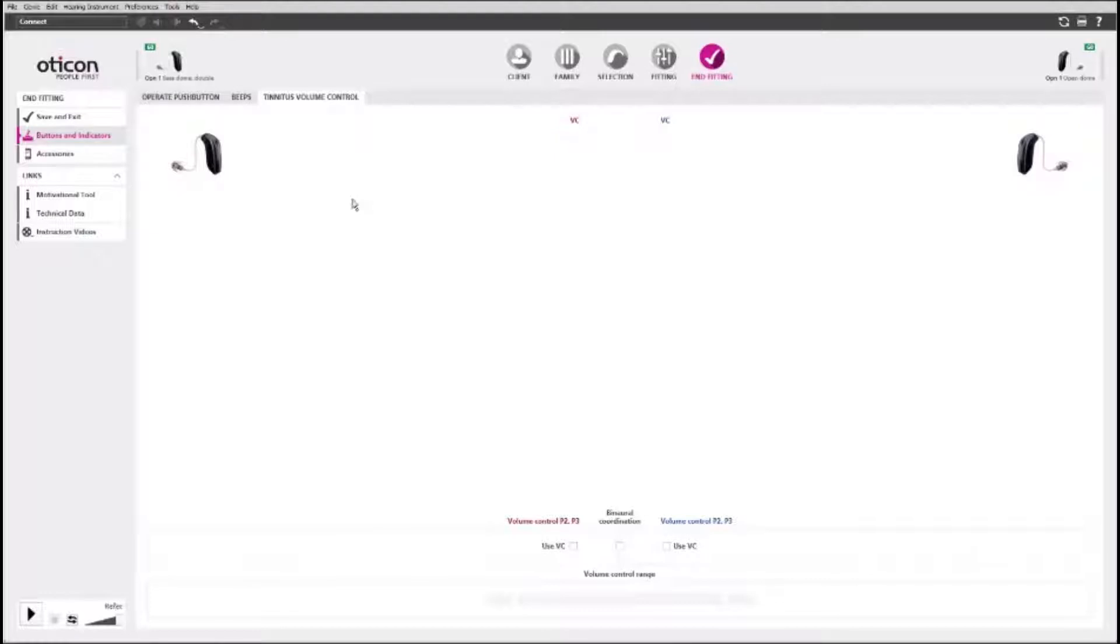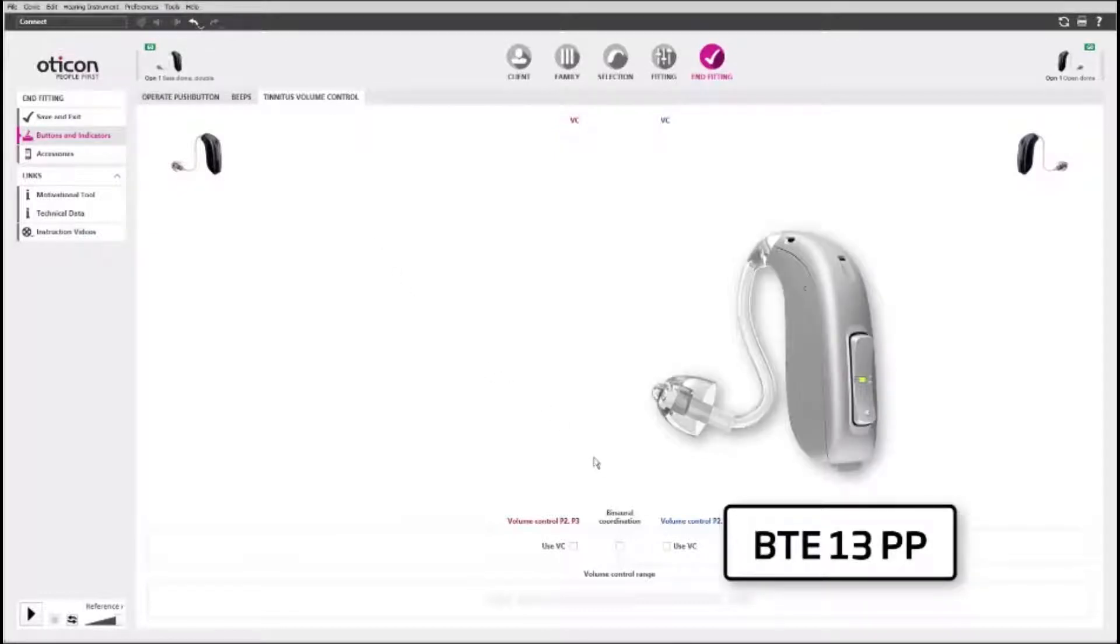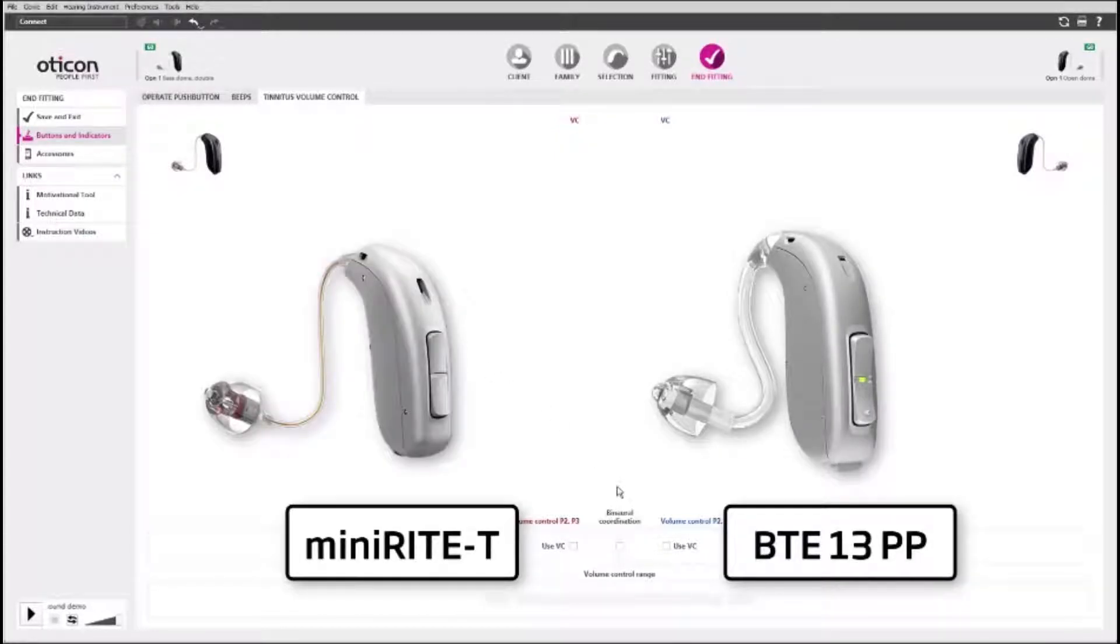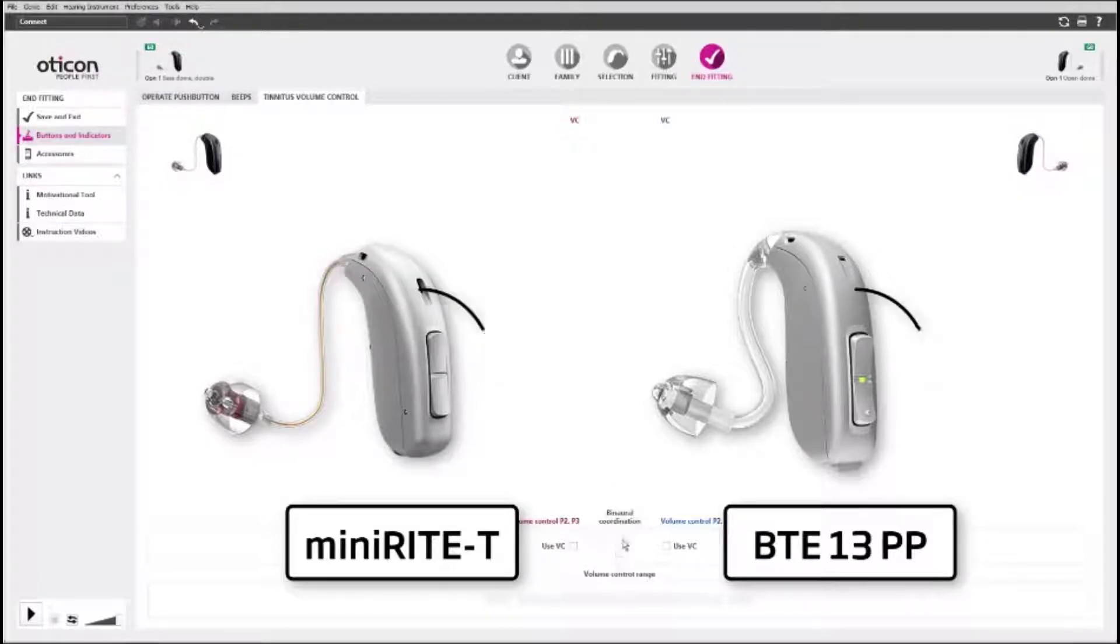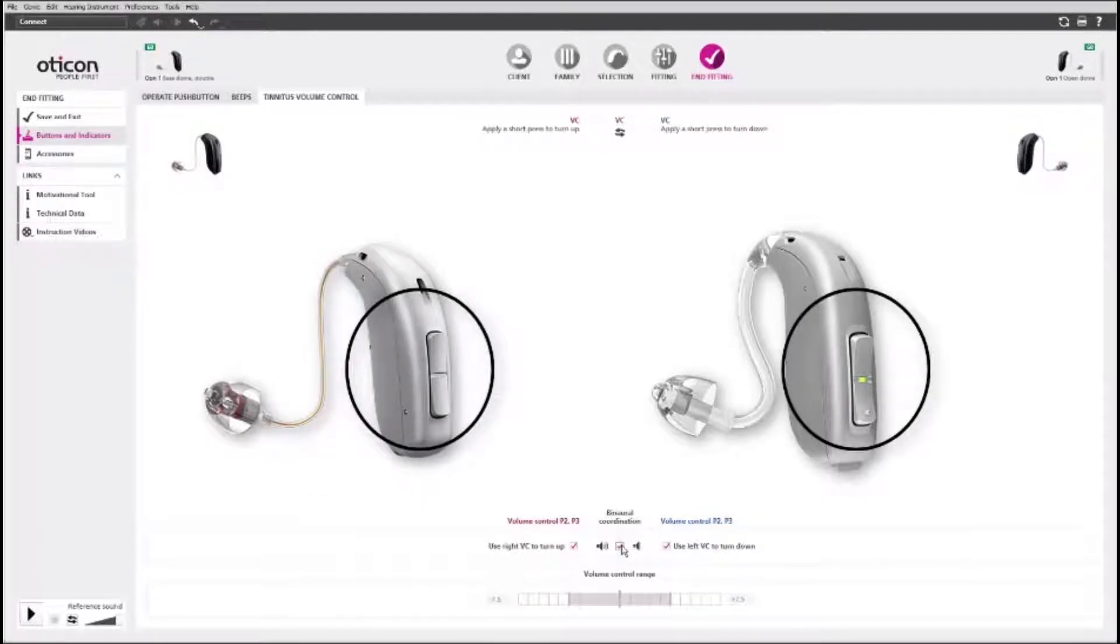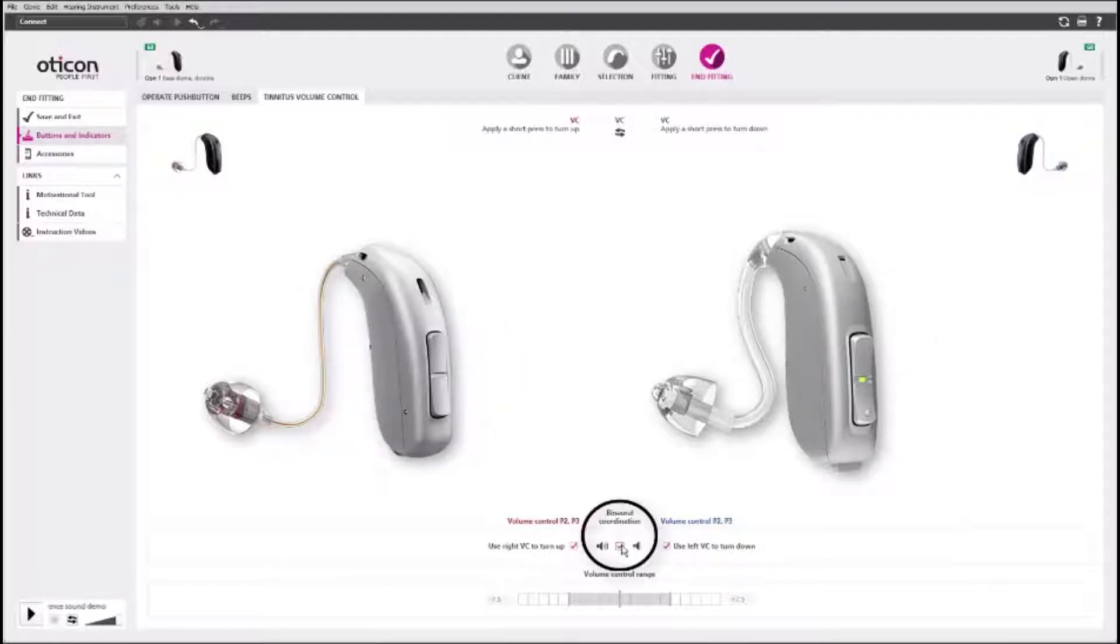If you are fitting BTE13 Plus Power or Mini-Rite T hearing aids, the double push button works as a volume control for tinnitus sound support relief sounds. It can be coordinated between hearing aids in a binaural fitting.